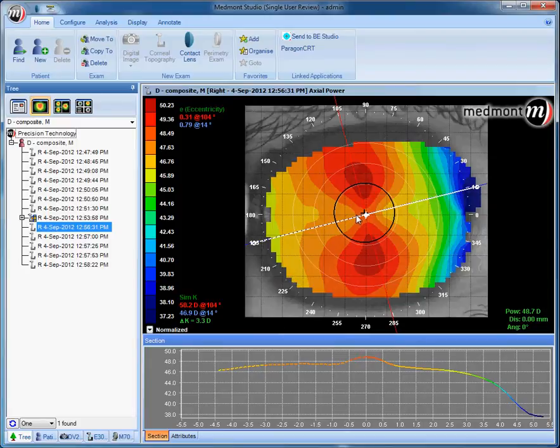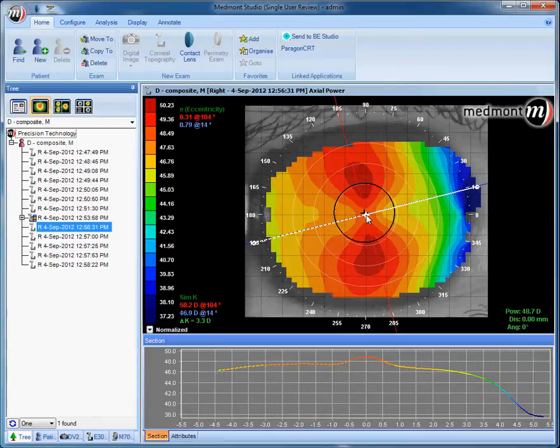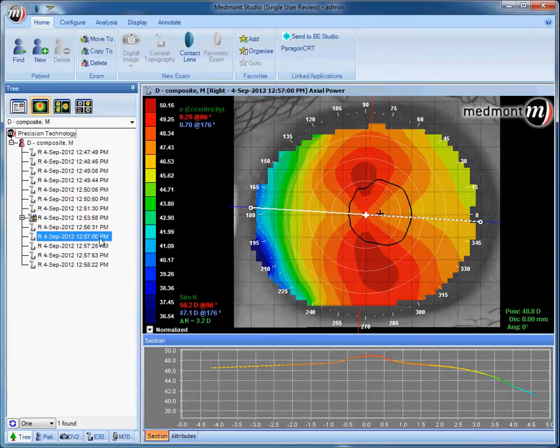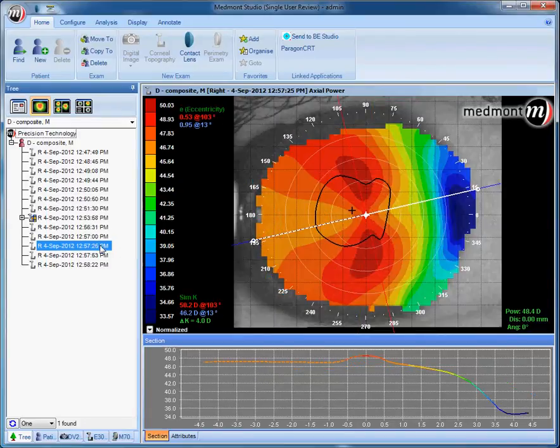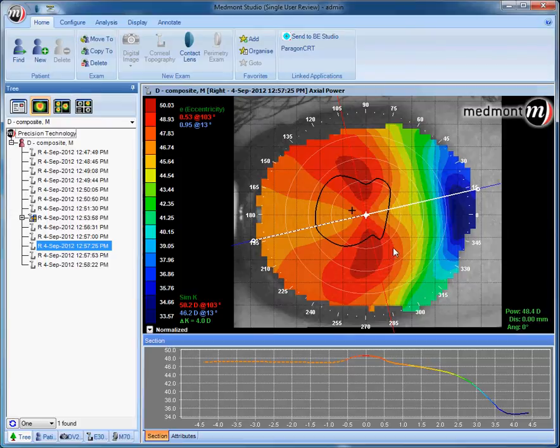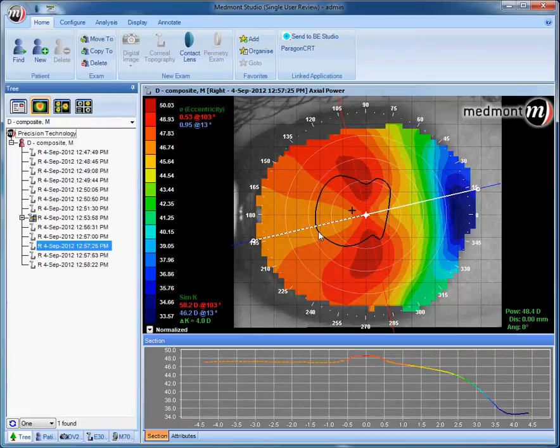Here's our image with the patient looking down the axis of the instrument, in other words, a normal fixation on the visual axis. The second image is with the patient looking three to five rings toward the nose, pushing the placido reflection toward the temporal side. The third image is having the patient looking temporal, pushing the placido toward the nasal aspect, three to five rings looking temporal.